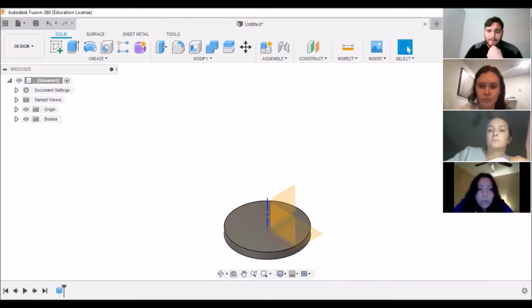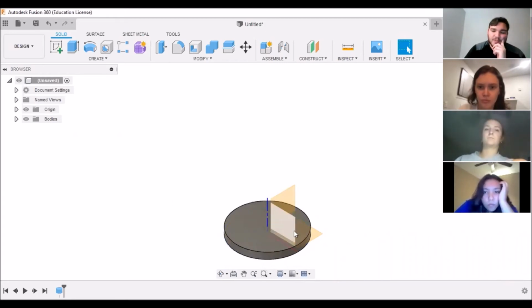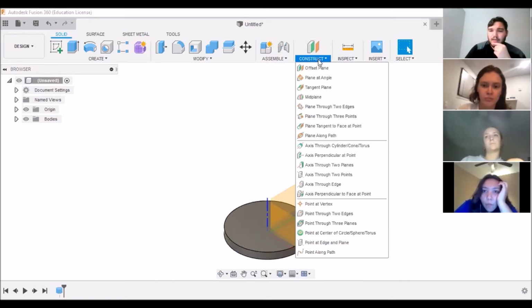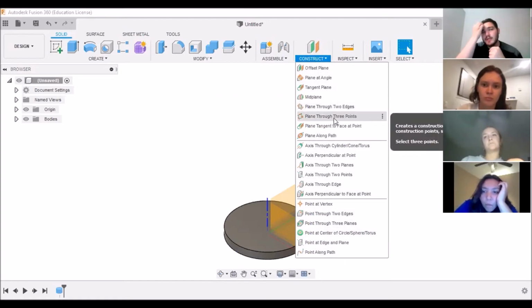So now here comes the fun part. Now we have to figure out how to make the little end caps, okay? Well, there isn't really much reference geometry that we can make off of here, right? Like we have the 3 middle planes, but from looking at the device, those aren't necessarily in the middle. So something that we can do is go to our construct menu. And if you look at the different constructions that you can make, this basically creates reference planes that you can allow for different geometries.